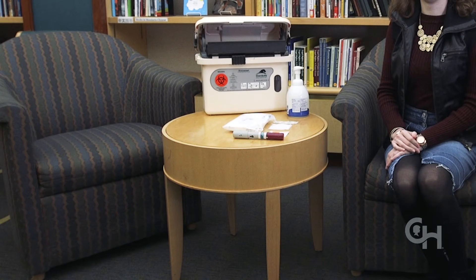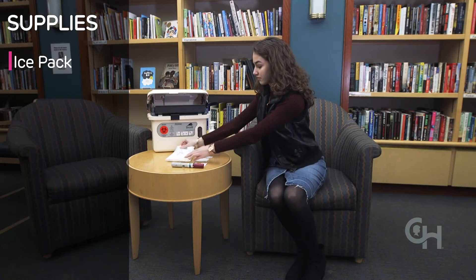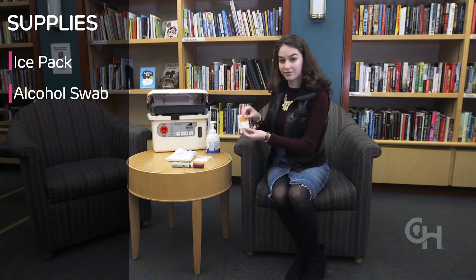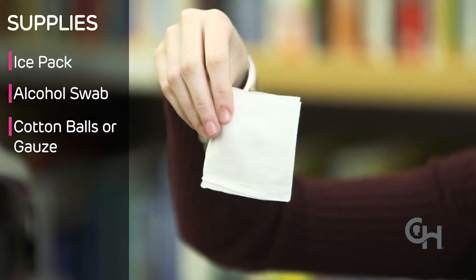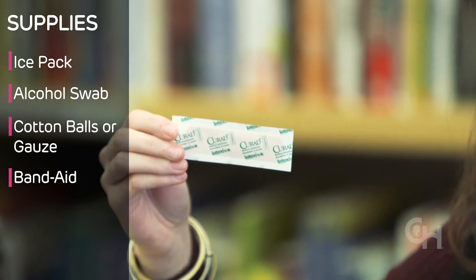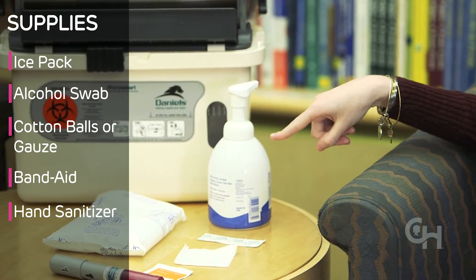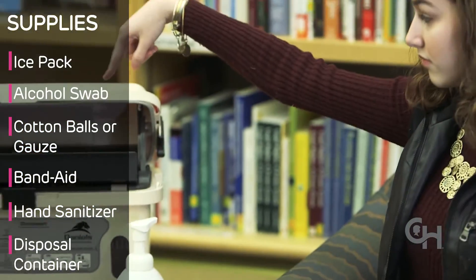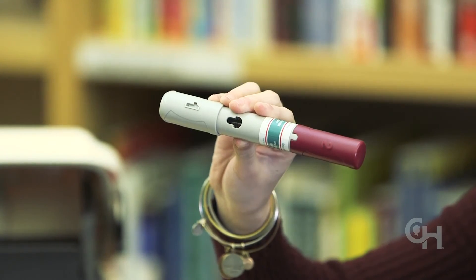The first step is to gather your supplies. You'll need a safe, clean area to get your medicine ready, and you'll need the following supplies: an ice pack, alcohol swabs, cotton balls or gauze, a band-aid if you'd like, hand sanitizer, a hard plastic container for throwing away the used pen, and the medicine at room temperature.